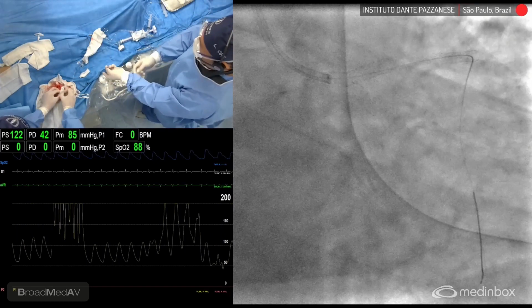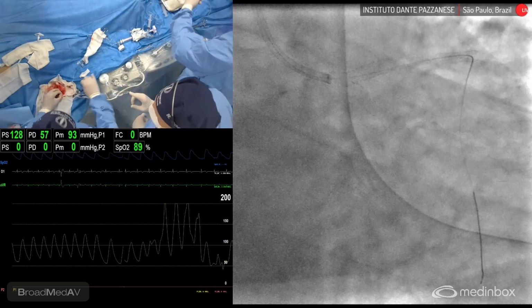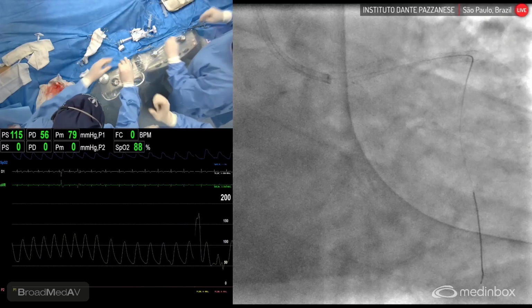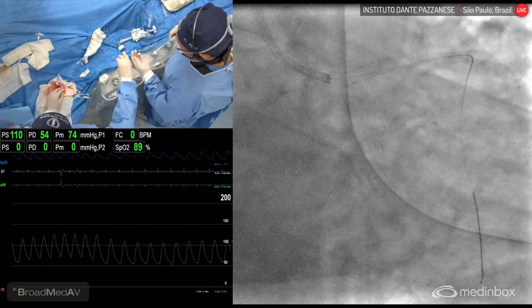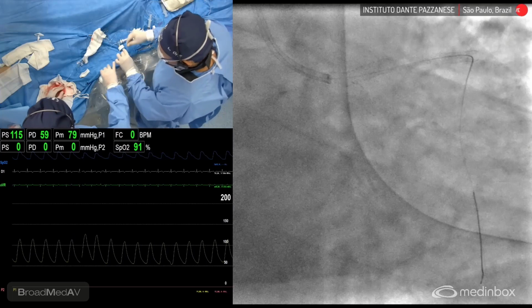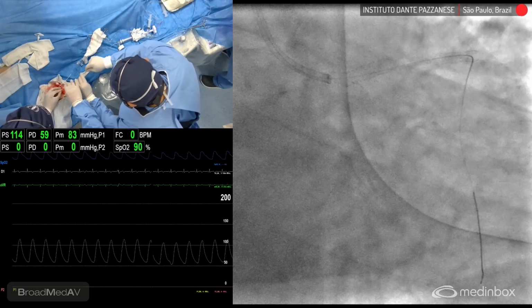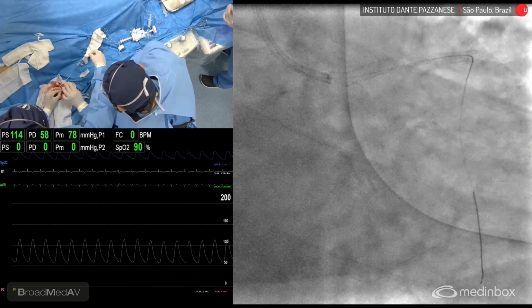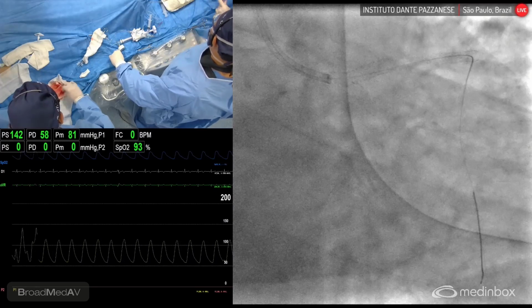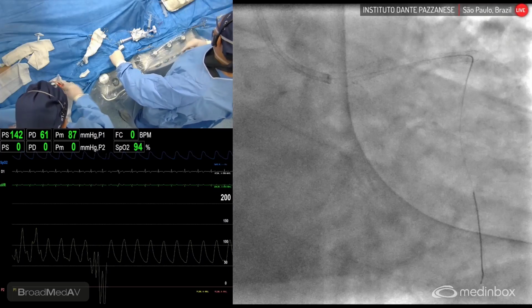So that's important. So now you're going to do the POT, and you're going to go with the 4.5, right? You decide 4.5, short balloon, for the POT, even though you have room outside, so you can basically fit any balloon there. But which balloon is this one? 4.5 by 6. Okay, it's a short one. So optimizing here, doing the POT.